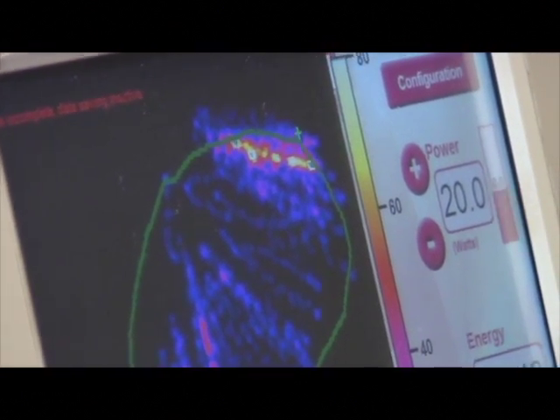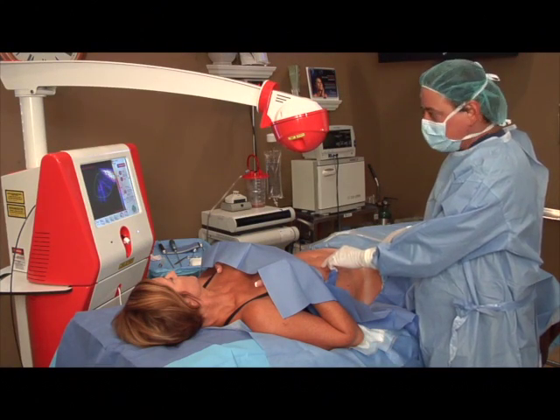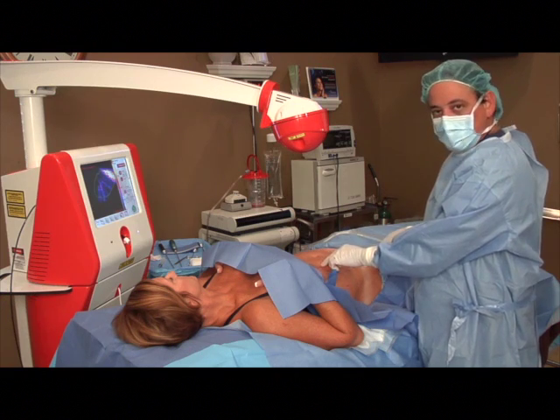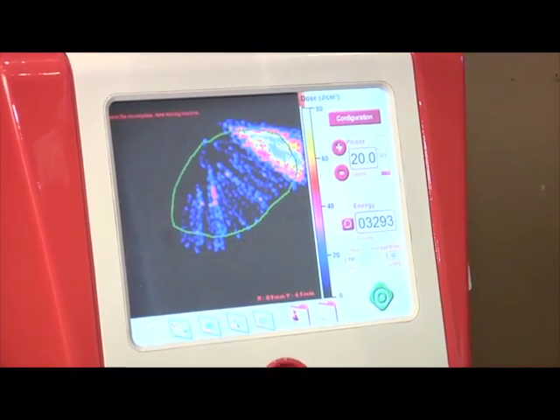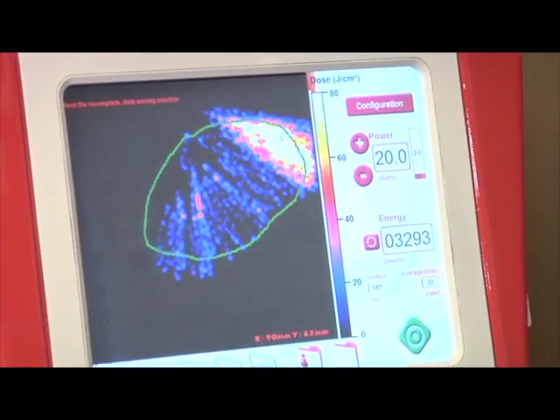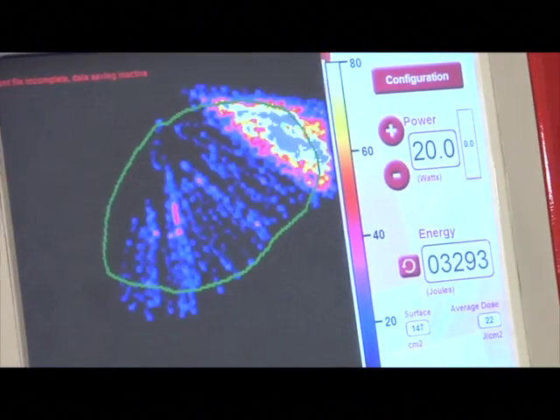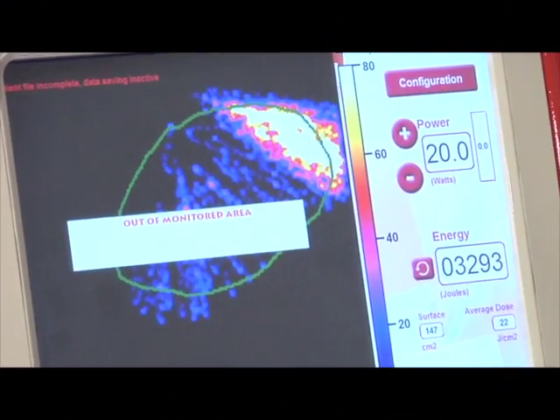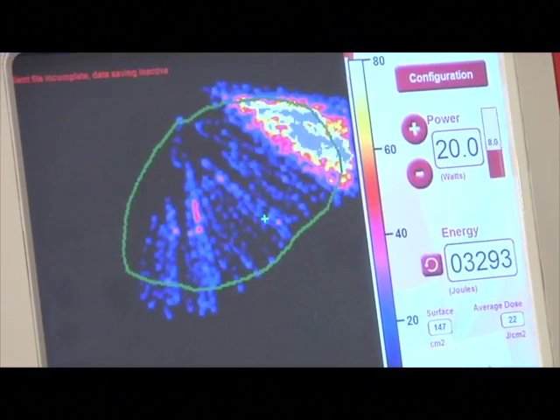Okay, now we've just done the top area, a small area of her upper abdomen, and you can see the screen on the top right that it's gray. It's flashing gray, indicating that that area is done. You can see the rest of the screen down at the bottom here has not been done, and it's still blue and some pink.